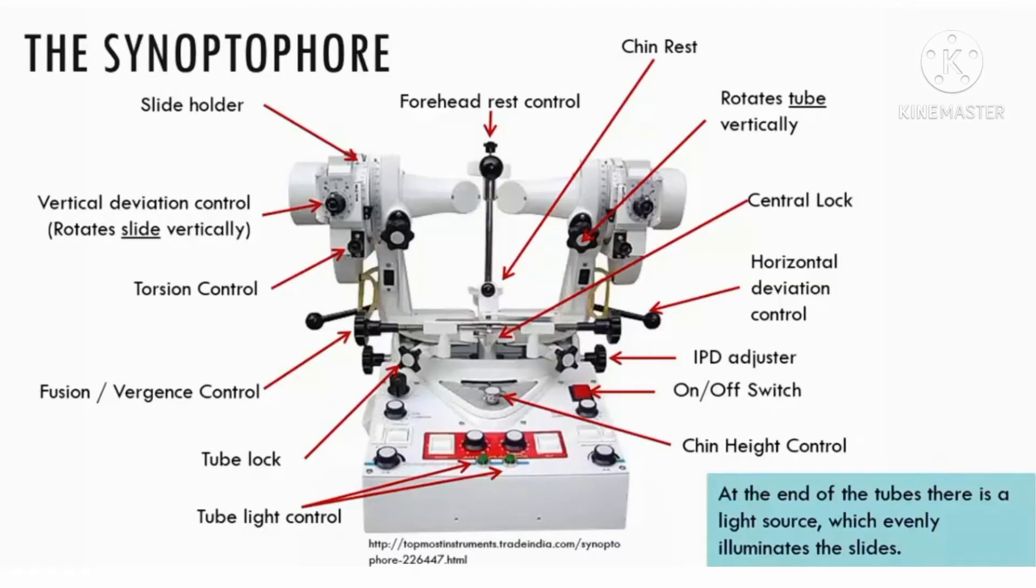Now let's start with the description of the parts of the instrument. First is the slide holder. There are two slide holders, one on the right side and the other on the left. Left slide holder mein dali gayi slide patient ko left eye se dikhti hai and right slide holder mein dali gayi slide patient ko right eye se dikhti hai.